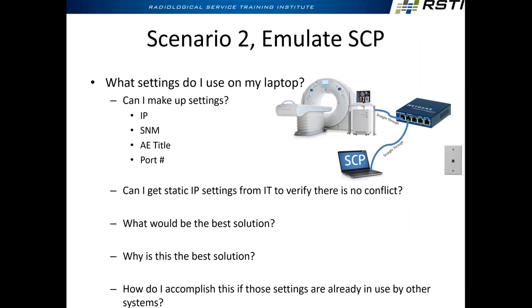So yes, that's a good point. A must have. And what I carry around now is on Amazon for $2. So it's literally adapters? Yeah, an RJ45 crossover adapter. So now I carry a 20-foot straight cable with me, and then the crossover adapter, so you can do basically any scenario with that. And no more wondering, is this a crossover one? That's why I started carrying those. Does this make sense? Yeah.